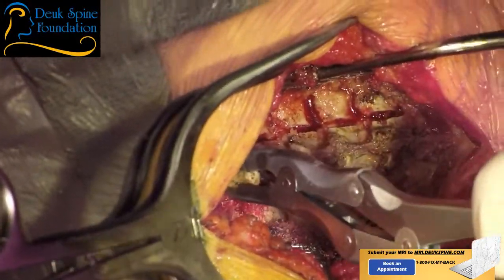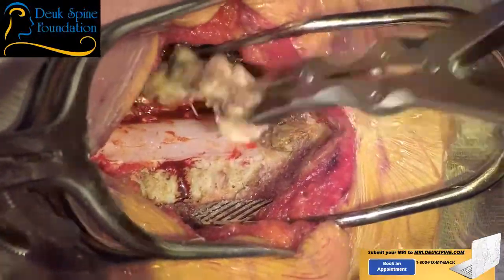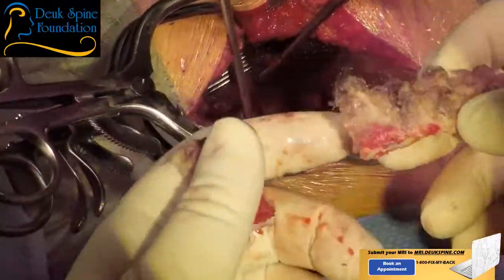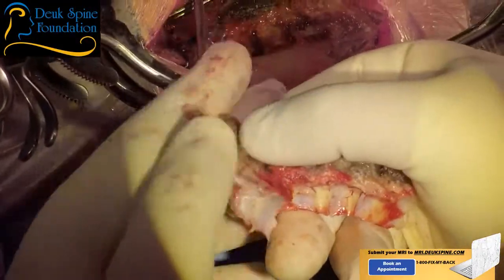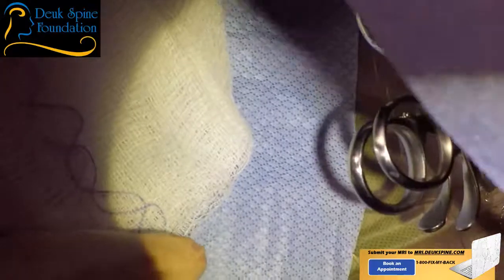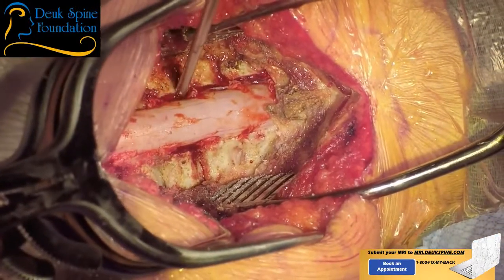All right, now here comes. Oh, well, we almost had it all out at once. Well, now the spinal cord's decompressed. Okay? So take that. Let me show you all. These are the spinous processes and lamina. You can see the ligamentum flavum there, the yellow ligament. It's a bit hypertrophied. We're going to clean all that up and use it. All right, looks good. Let's see what we got there. It looks like a vein, huh?